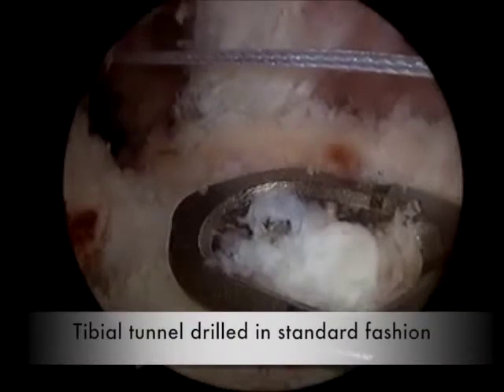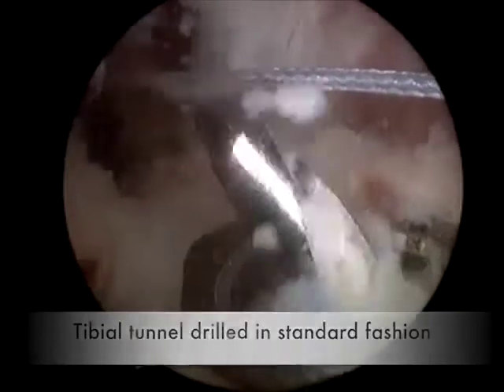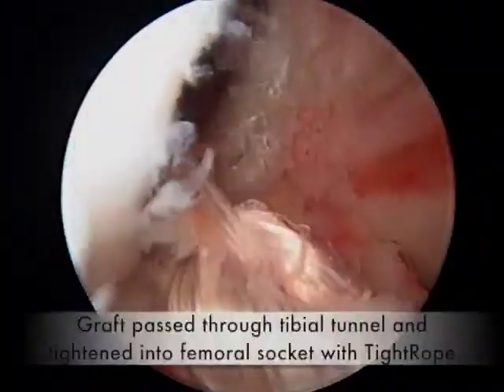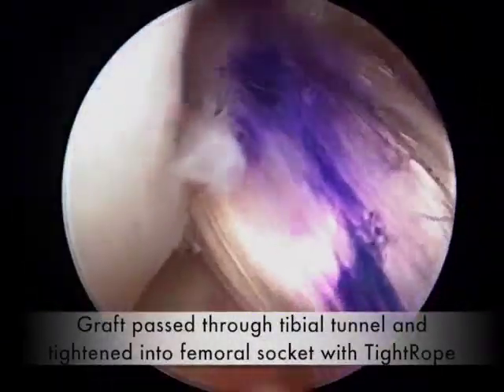Similarly, the rounded tibial guide is used to find the middle of the tibial footprint, and the appropriate size hole is drilled from the outside in. Through this hole, the four-stranded hamstring graft is pulled into the femoral socket and tension.